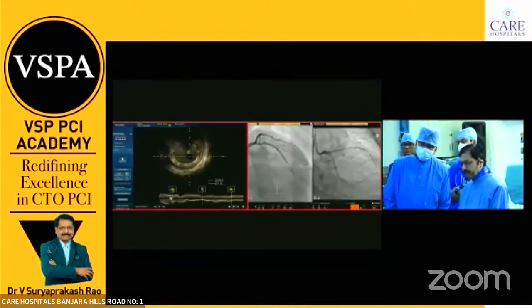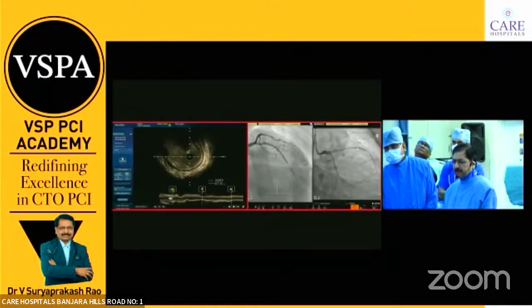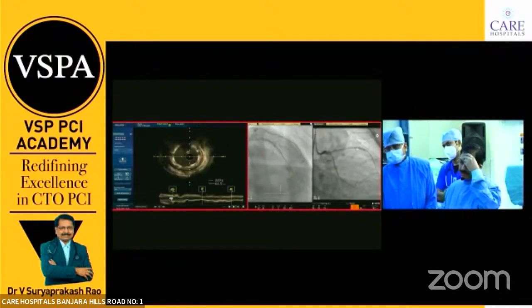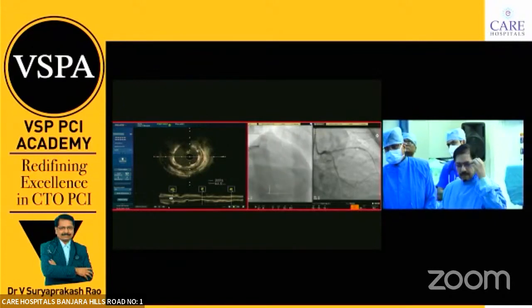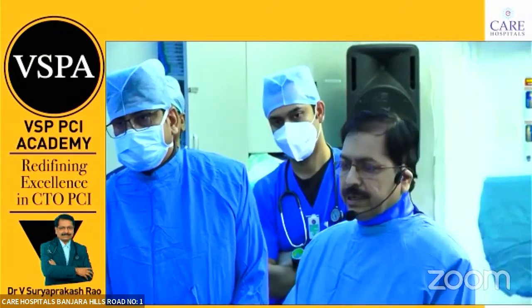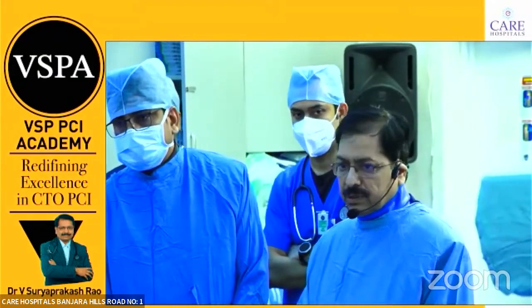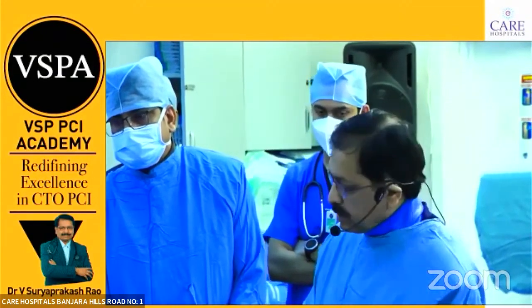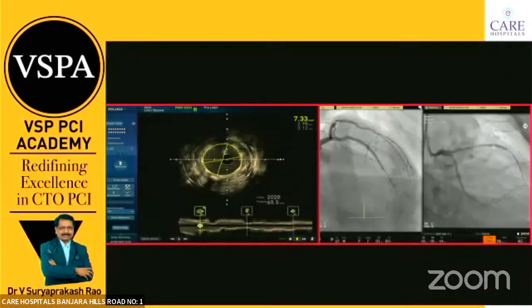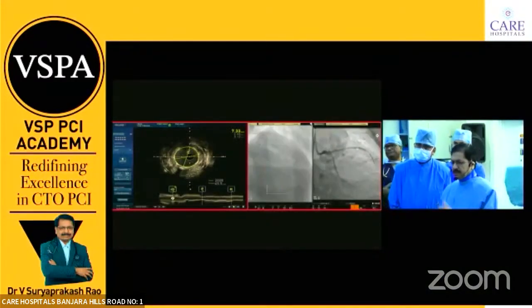But I think we have seen many times over 6 months time the distal LAD is likely to grow, and we'll do a check angio or a CT on the follow-up. The access has been closed with the Angio-Seal on the right one. So usually we do it to avoid vascular problems. Also, the contrast used is around 180 ml and 5 gray radiation, but it's not expected to be that high because of his obesity.